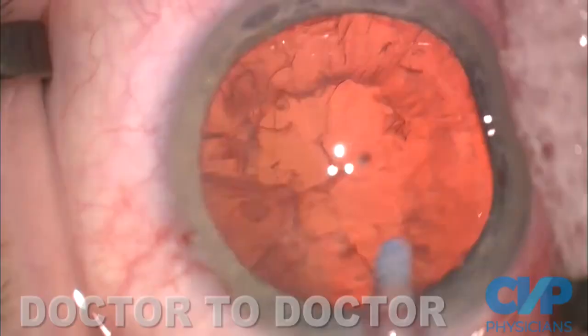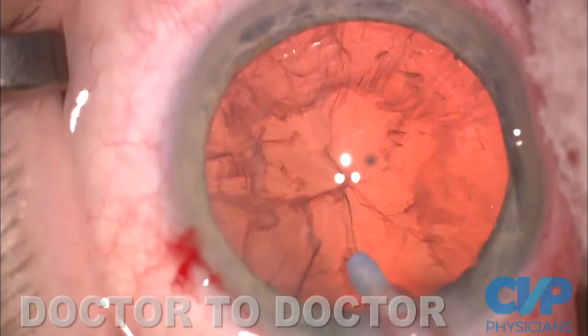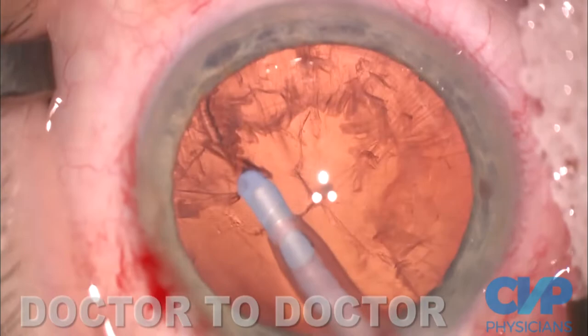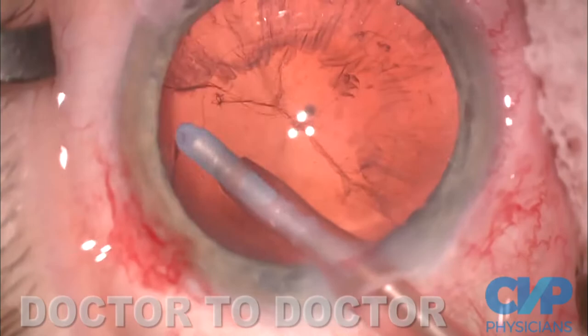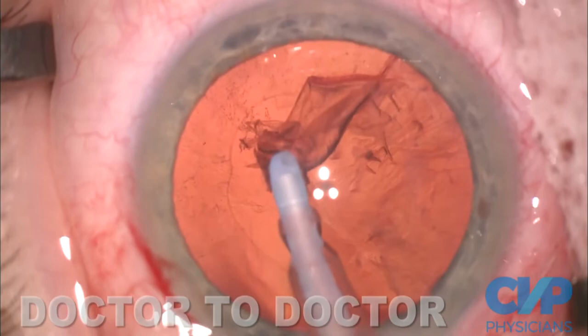Now I take the cortex — always the sub-incisional cortex first. It makes sense not to take the easy approach and go across the eye; I've been saying that for decades. The cortex is holding open the bag, and if you wait to do the sub-incisional cortex until last, the bag is closed and it's much more difficult. We only engage the most proximal anterior sleeve of cortex, because if you engage the posterior sleeve, you're going to get little ribbons and things that are not very sociable.